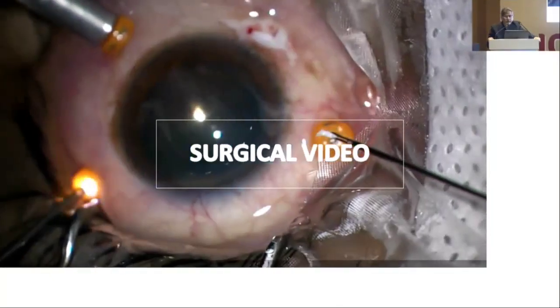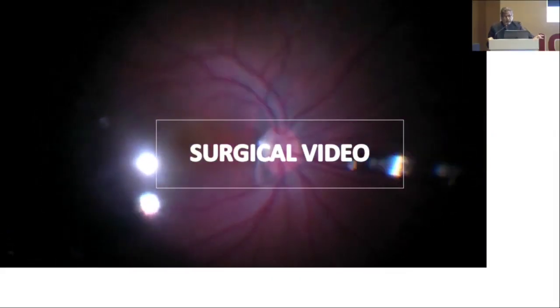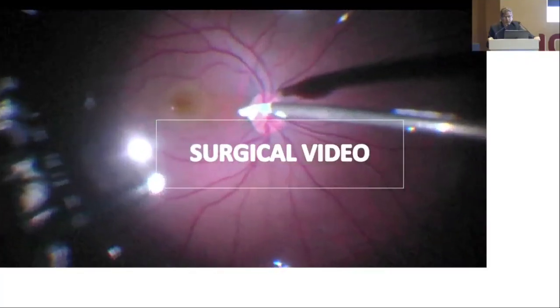Now you can see with the VR, I am taking this flap and placing it over the disc. Initially we were afraid because of damage to the optic disc and circulation and all these things, but now we are confident of putting this scleral plug. Actually we have to identify the size of the optic disc pit before inserting this inside, because we require watertight closure. We have done ILM peeling, but ILM peeling is not sufficient. It does not stick to the optic pit.